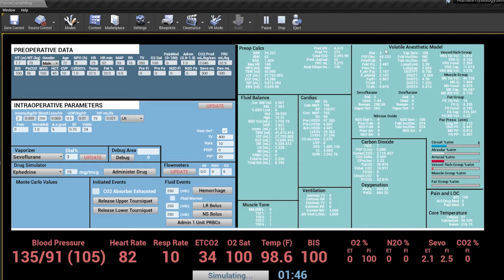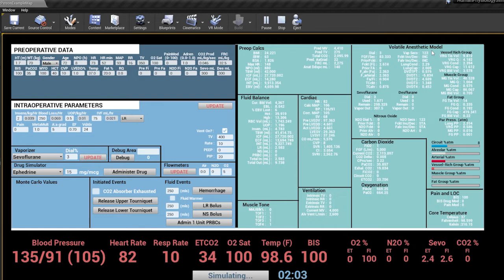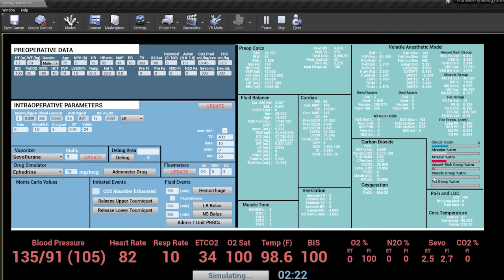Up here in the top right, we have the volatile anesthetic model, and I'm using a four-compartment model. We have the anesthesia circuit, because anesthesia doesn't build up to 100% of its value in the circuit immediately — that takes a little bit of time. Once that amount is calculated and delivered to the patient, it goes into their lungs and circulatory system, and gets redistributed to the vessel-rich group, the muscle group, and the fat group. This little chart right here is calculating the amount of accumulated anesthetic in these different groups. You can see the vessel-rich group is starting to pick up some from the arterial side, the muscle group hasn't really started to accumulate very much, and the fat group hasn't started at all.